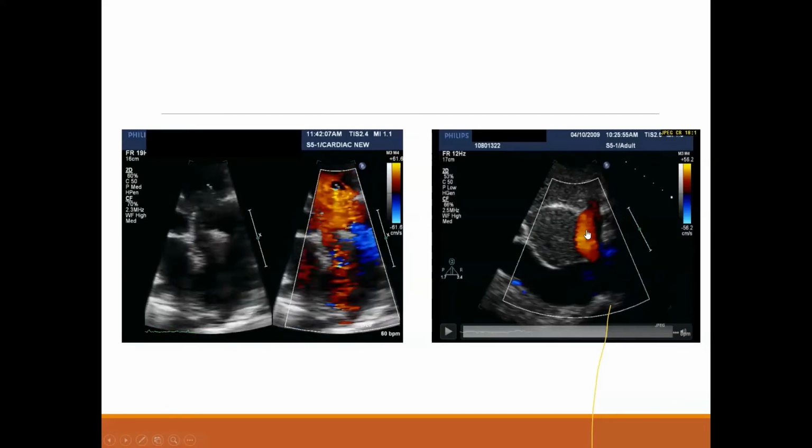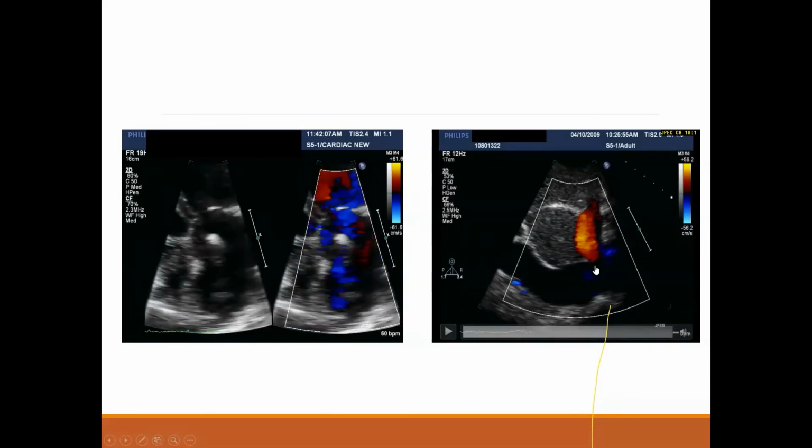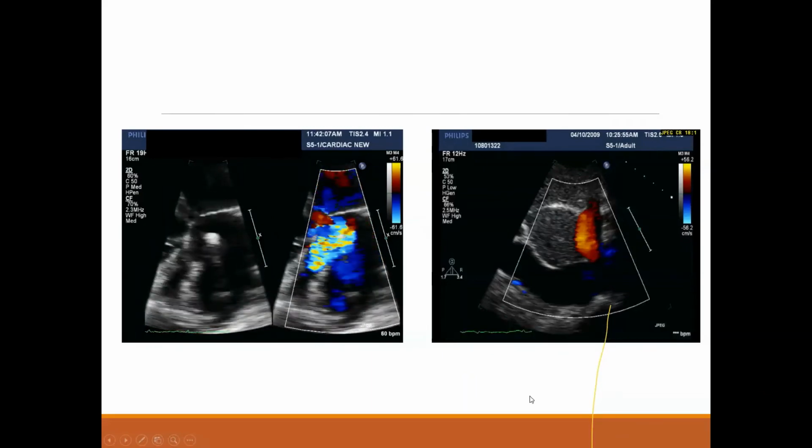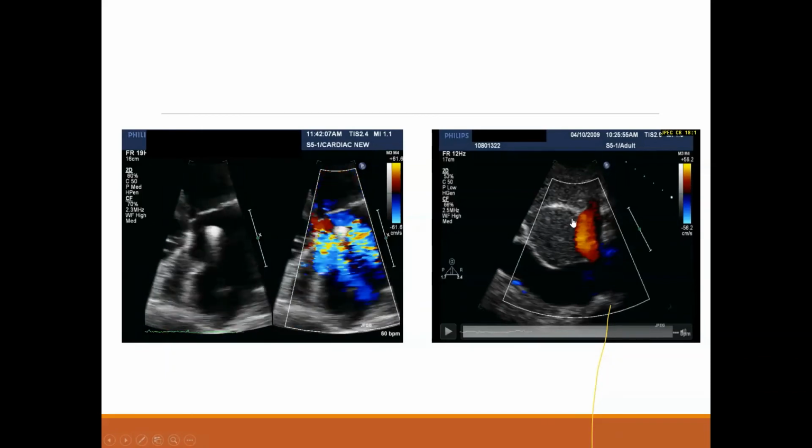So that is non-physiological flow, right? Well, yes. I wouldn't say non-physiological. Having this much flow is non-physiological. I have systolic flow reversal in the hepatic vein. Because I have used the ECG to tell about the time, systolic. And it is flow reversal based on the direction and the color of the jet. So this is a reversal during the systole in the hepatic vein.